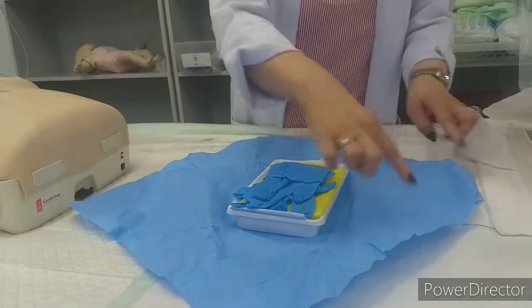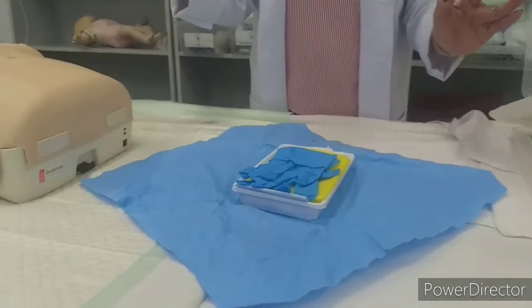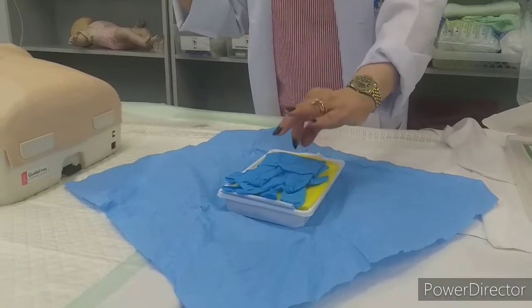Okay, so all of this area inside of this is sterile. So never touch whatever is there with your unsterile hand.